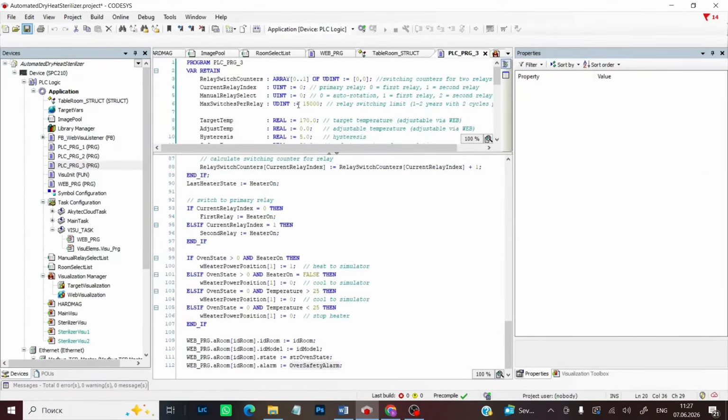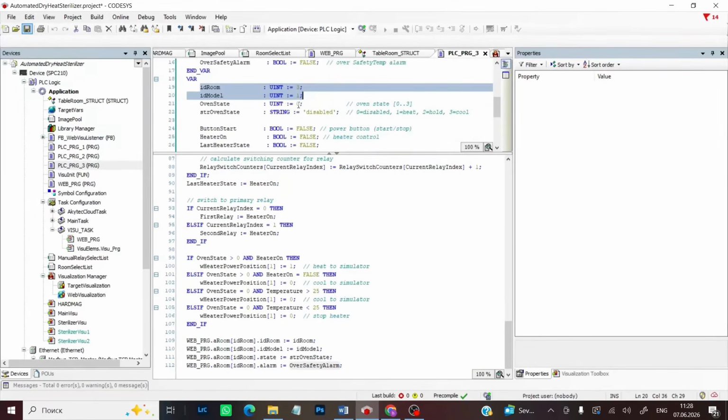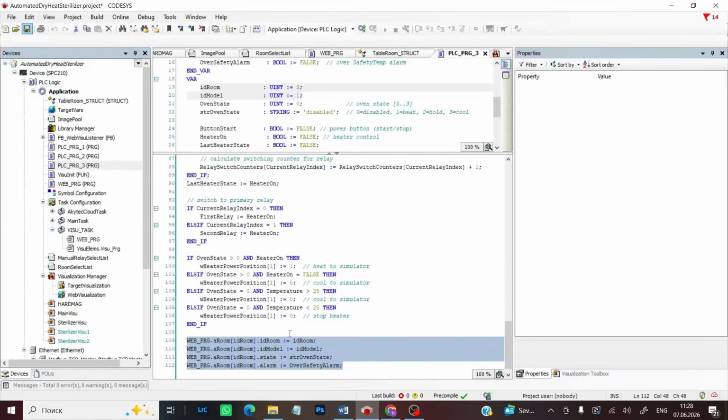If you noticed, for the third room I duplicated the first program, and in each program I added 2 more variables, the unique room number and the sterilizer model. And at the end of our control algorithm, I added expressions that populate the elements of our array.